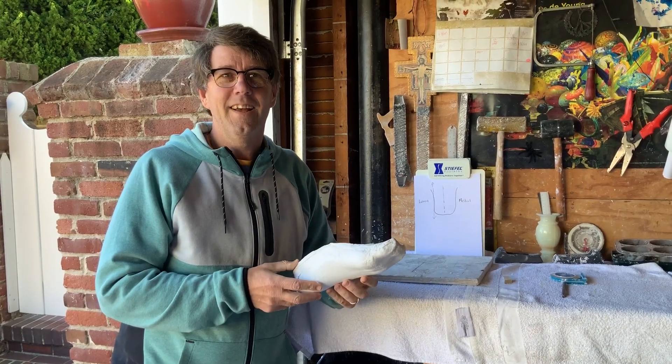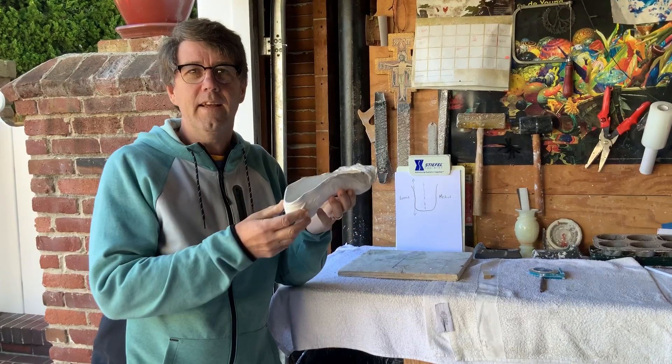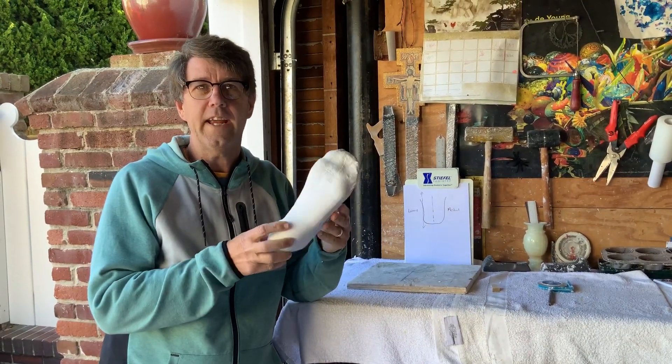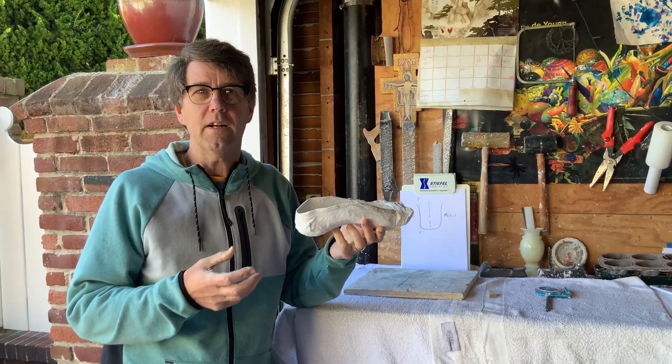Hello class. Today we're going to talk about bisecting the heel of the negative cast that you've taken, and that will be the first step in making an orthotic device.